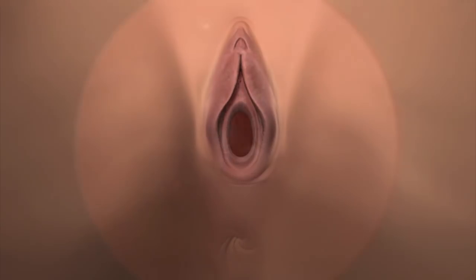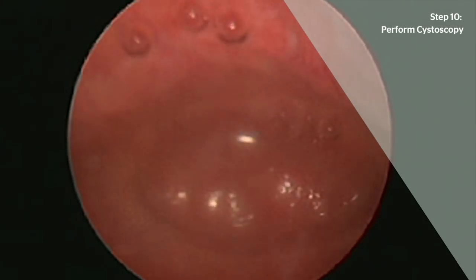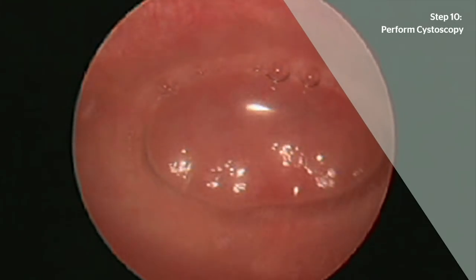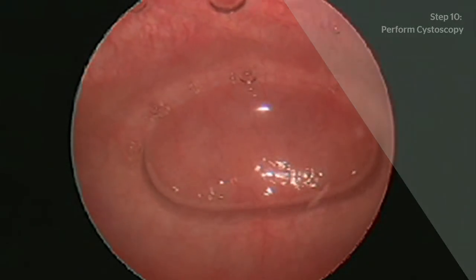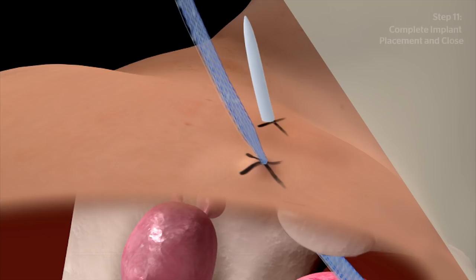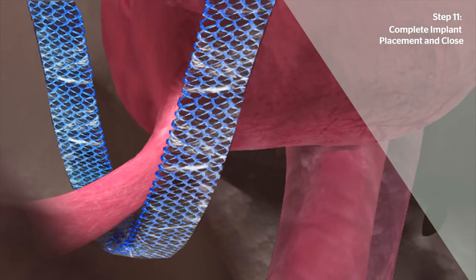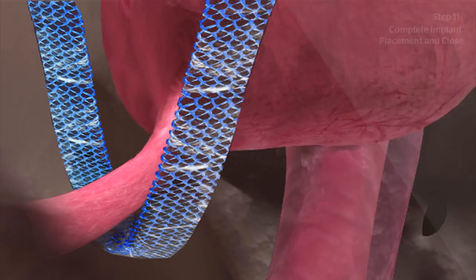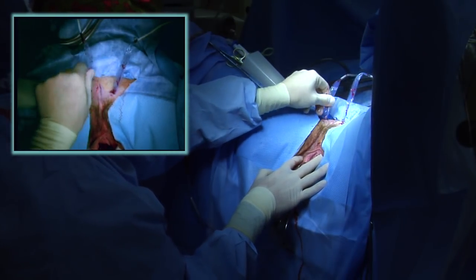Remove the 18 French Foley catheter and perform a cystoscopy to confirm bladder integrity. Gently pull the trocar sheaths upward to bring the implant loosely under the mid-urethra. Adjust the implant to desired tension.